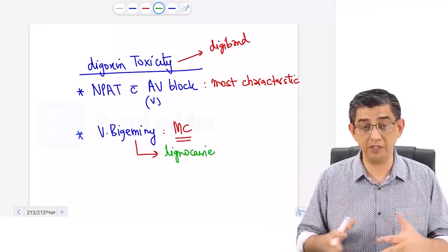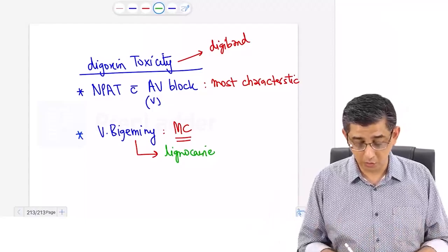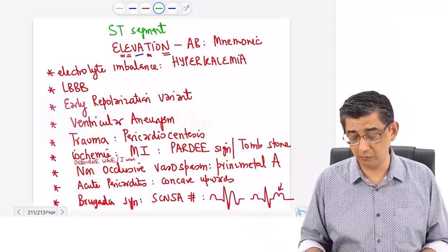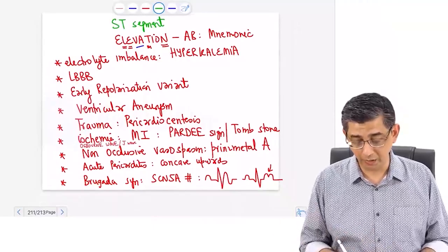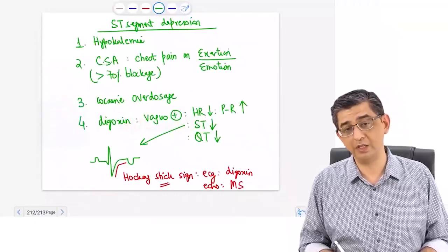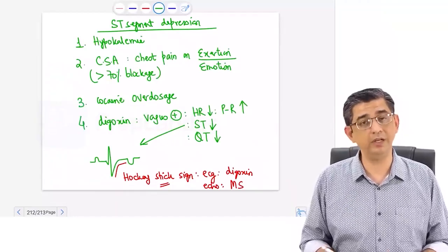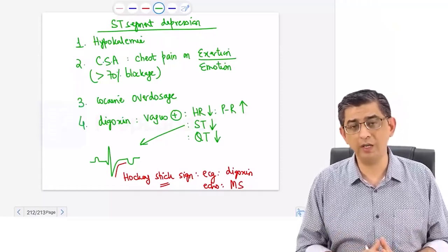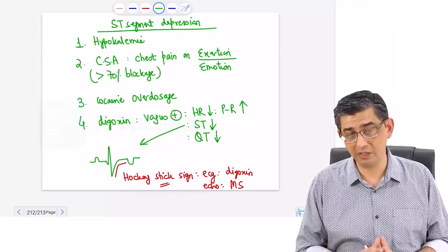And if ventricles beat faster without getting filled with blood, we call it ventricular tachycardia. So causes of ST segment elevation and depression are less likely to be forgotten, because of the usage of this mnemonic. Again, try to hand note it down by yourself, though it's given in the notes, and compare that with causes of ST segment depression. In fact, most guys do very well with ST elevation and ST depression because it's very fascinating. I usually have not had any problems with people understanding or remembering these aspects.